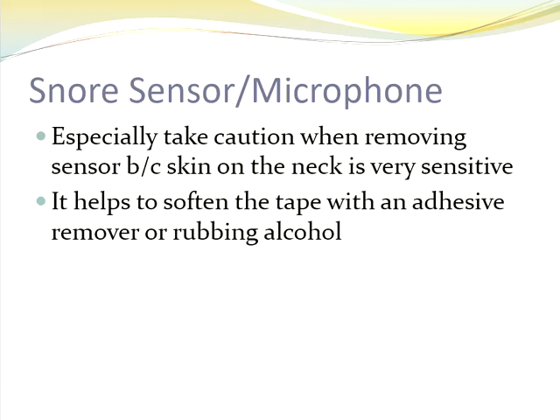This is one of the few electrodes that we don't have to prep the skin for. You might find that just cleaning the area a little bit with rubbing alcohol will help your tape stick. It would remove any skin oils and anything that might prevent the tape from getting a good adhesion.